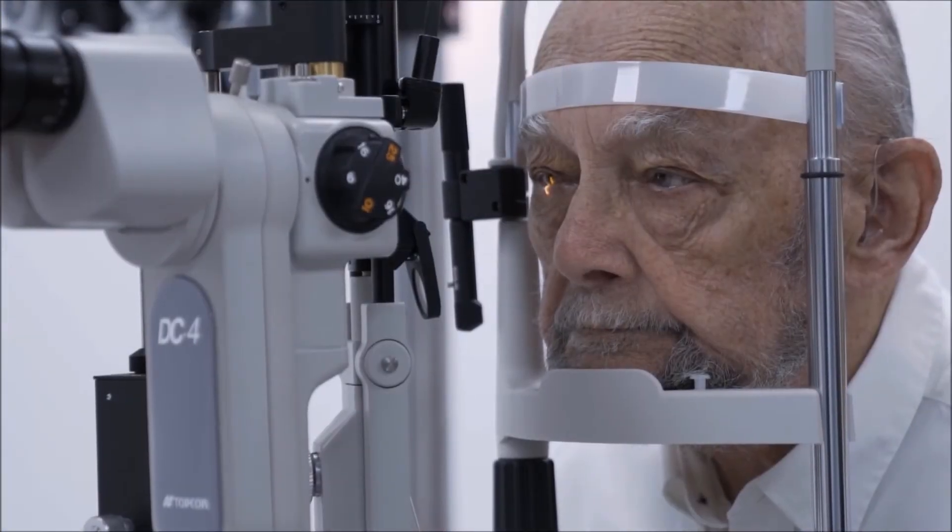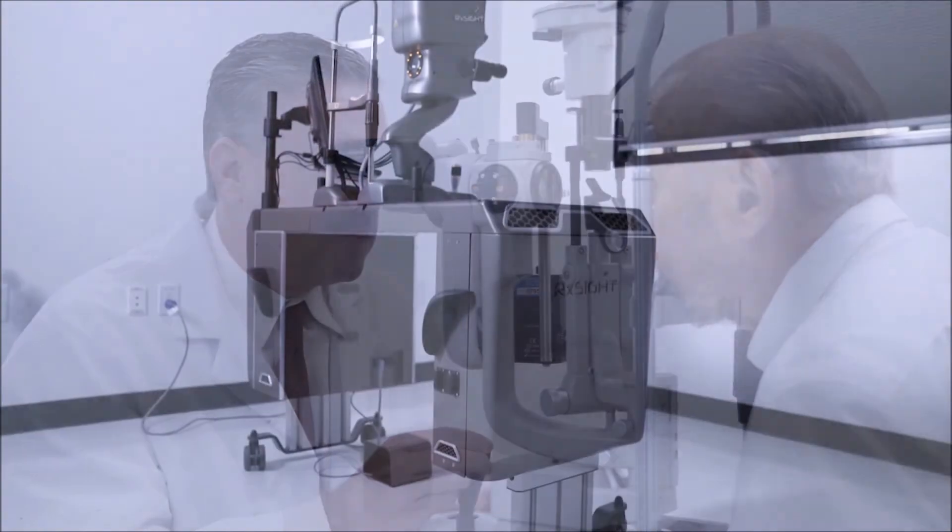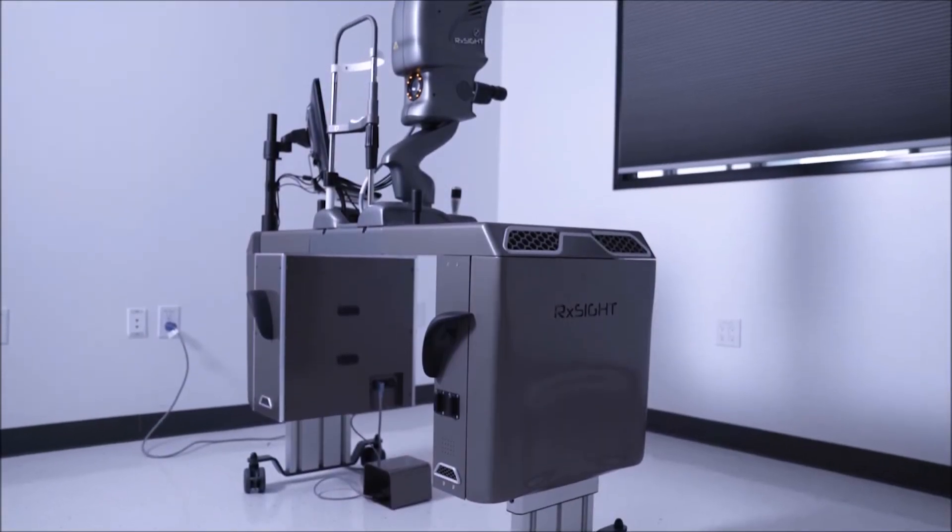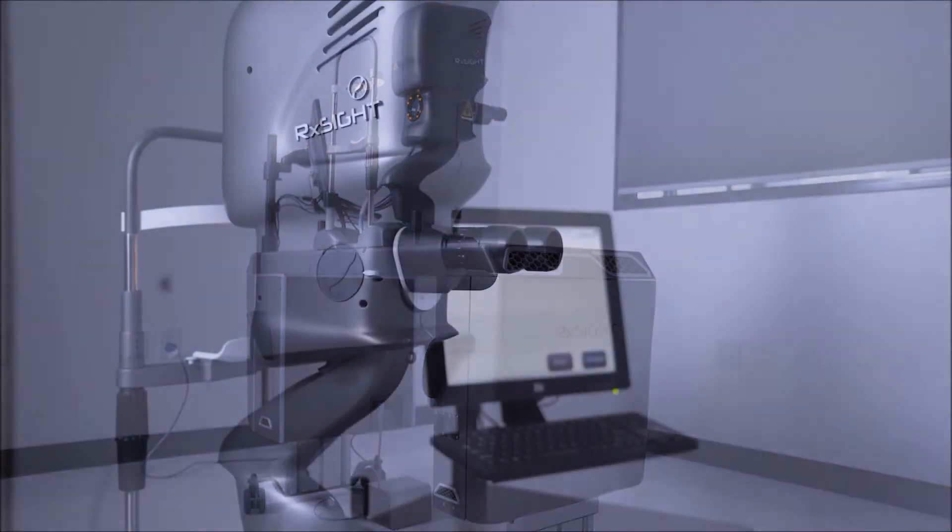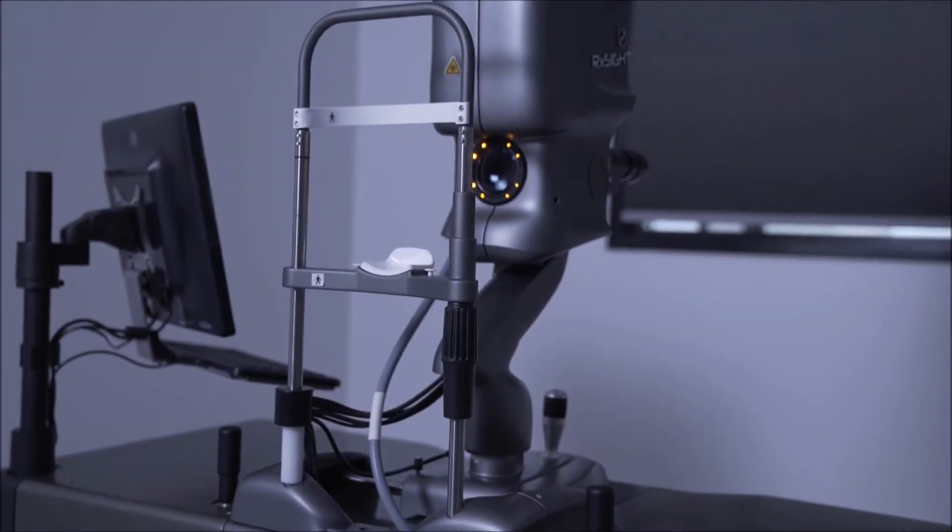approximately 2 to 3 weeks after surgery, the patient returns to the practice to have their vision evaluated. This evaluation determines the type of UV light treatment pattern the doctor will deliver via the office-based light delivery device to create the desired refractive outcome.